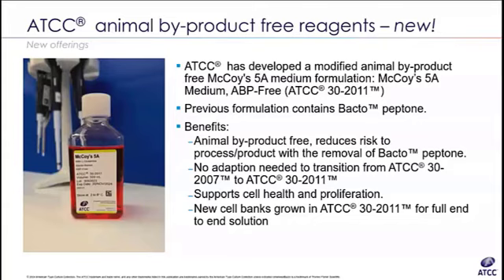Instead of having 2 sources of animal byproducts in your system, you've eliminated one. So now you have your serum, and serum is becoming more and more better qualified. There's a lot of regulations around it. So it's a very defined animal byproduct. Hopefully, eventually in 20 years, we'll all be animal byproduct free, but as we get there, this is the first step forward. Nice.